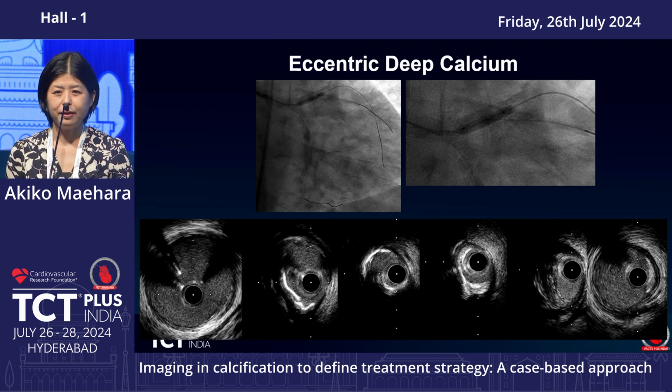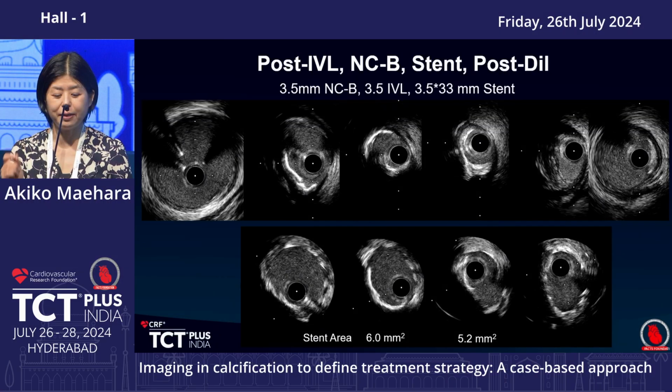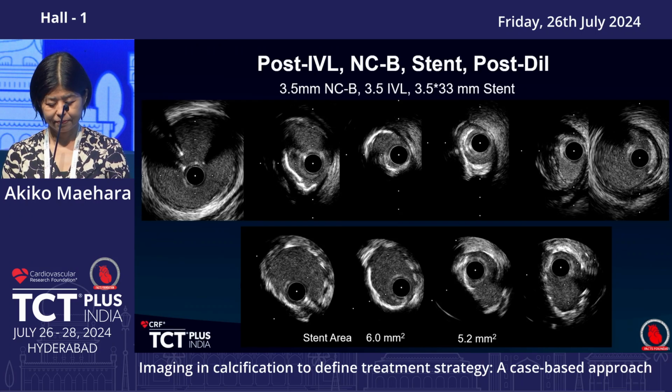That's what we thought. And we ballooned, but it doesn't open well. And Ajay wanted the IVL, even though I was against it, he did, but IVL doesn't work. And at the end, we ballooned. At the end, okay expansion, but not impressive expansion. And this is a type of case which is typically difficult, eccentric, the surface is not too much, and we thought it's okay. We may have to do more, that's our learning point.